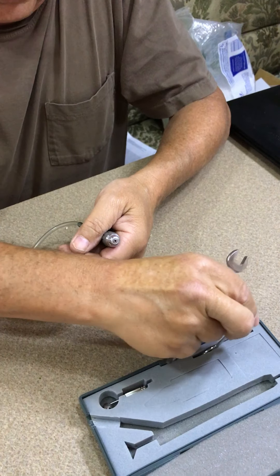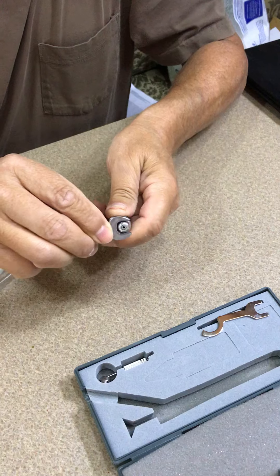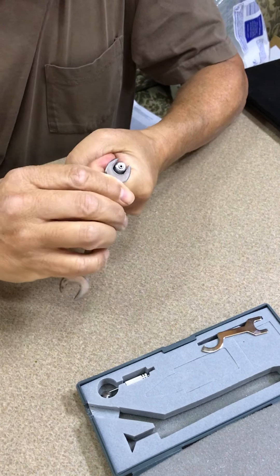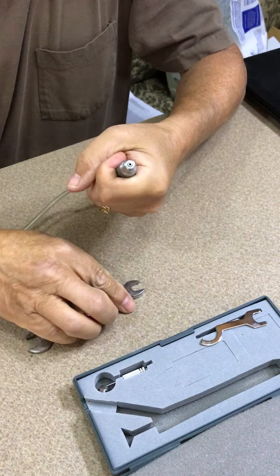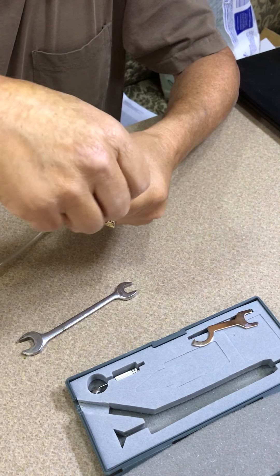Put it on the flat spots and unscrew it counterclockwise, just like unscrewing anything else.